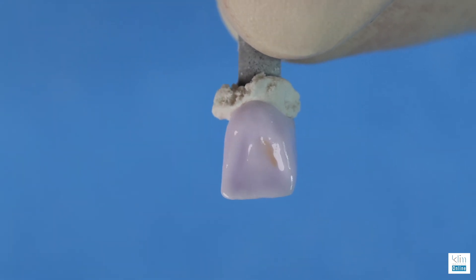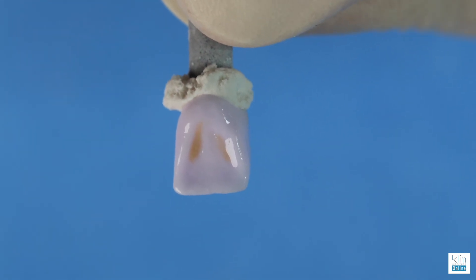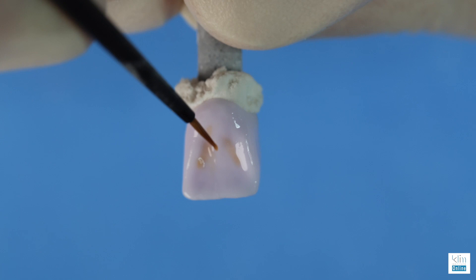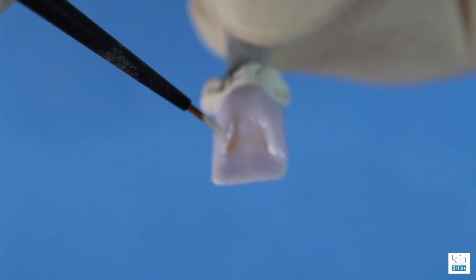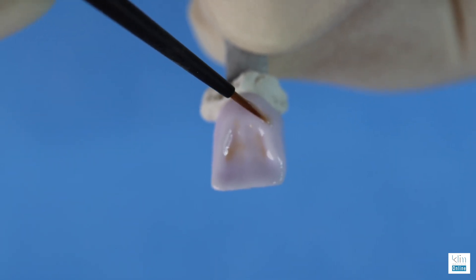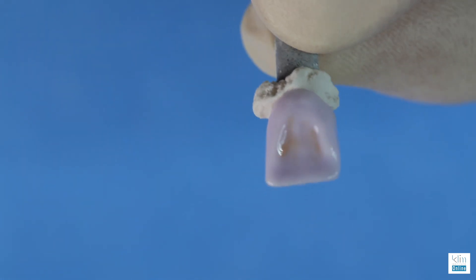We're going to add some dentinal shade to the fossa side of the central and float and dilute that high saturation. And just for practice, we can add some Lumen to the line angles — it will create a higher value where the dentin is thicker. This is fun — this is the craft of dentistry.